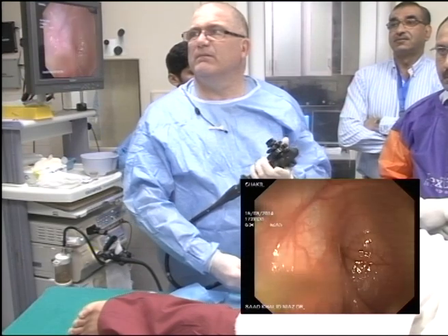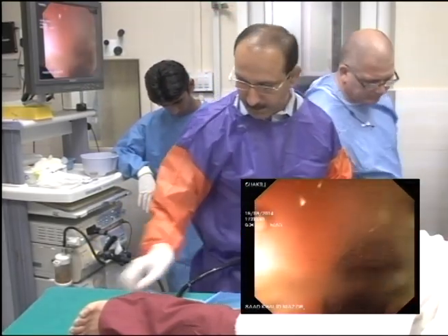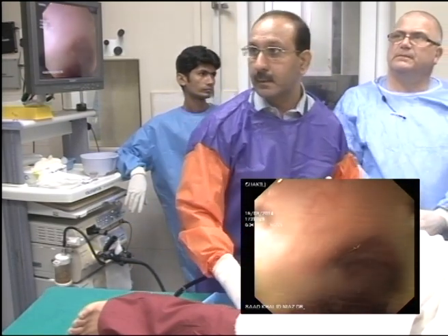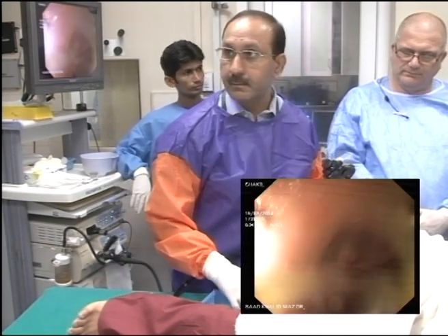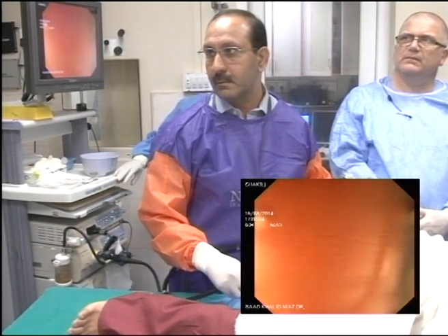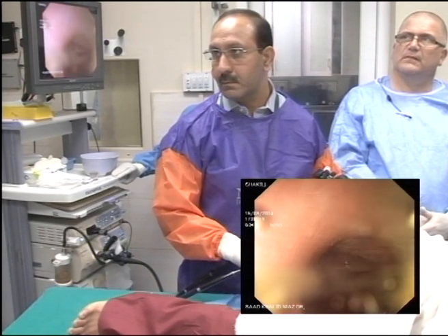My problem is that if I write there is a small tiny polyp and I don't take it out, then in the society that we live in, we have a lot of issues. They go to another doctor who says, "Oh my God, this doctor has left a polyp that can turn into cancer." So what will happen is they will end up having another colonoscopy, and that other person will take that polyp out. So my practice is generally to take anything that I see which looks like a polyp, take it out.